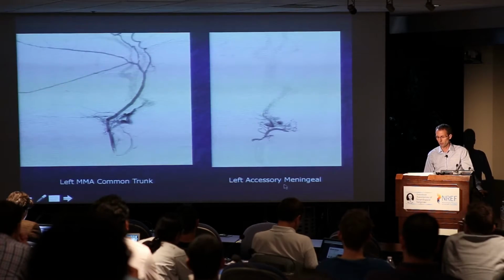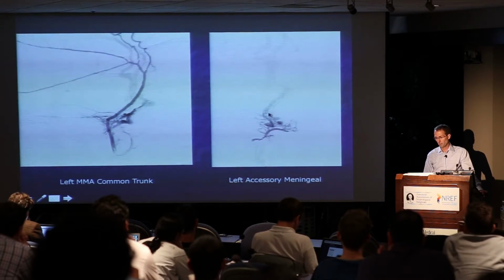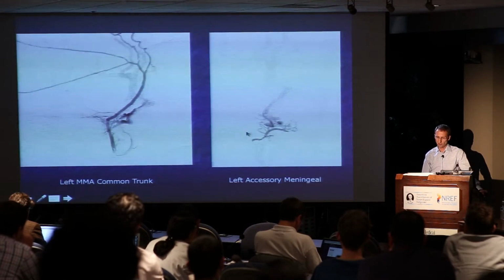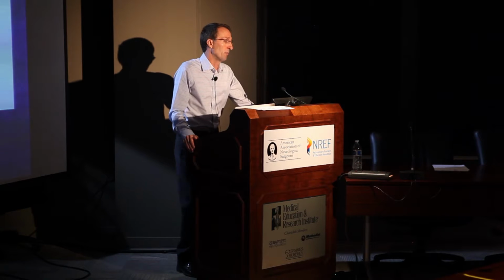I looked a little distal on the IMAX into the accessory meningeal, and I felt like we could get fairly close to the fistula. Again, there's the venous pouch. The fistula actually is located more near the base. This is the fistula pouch, and then there's the outflow to the cortical venous drainage. But again, I'm just immediately downstream of this, and I still don't want to embolize the fistula and have any concern for retrograde flow in the petrous branch.